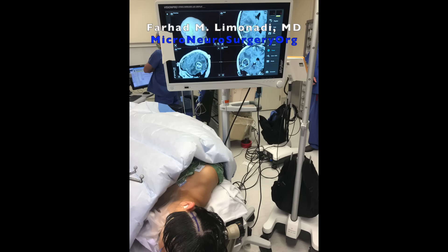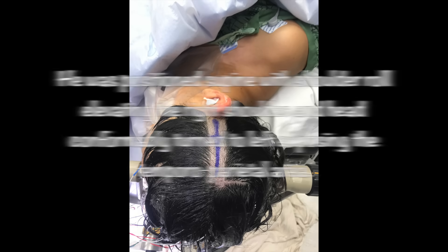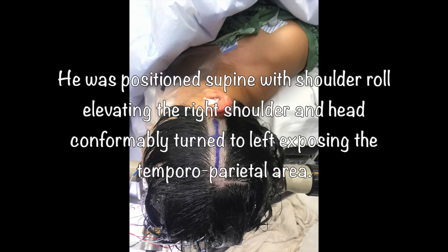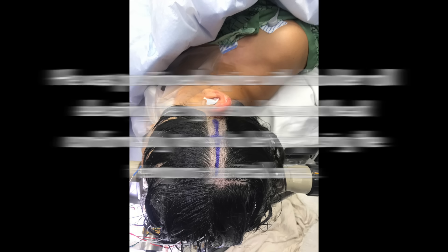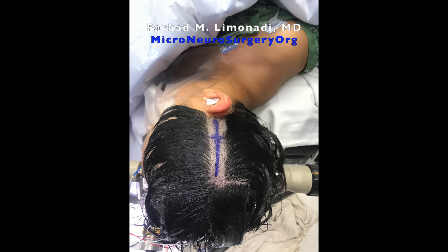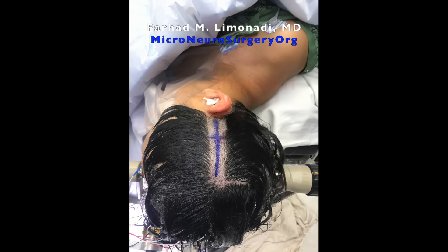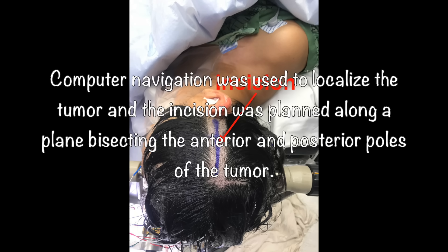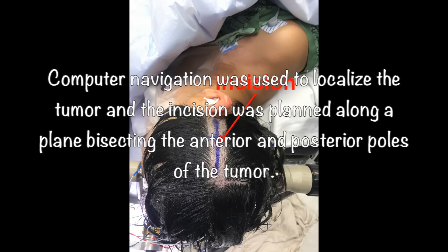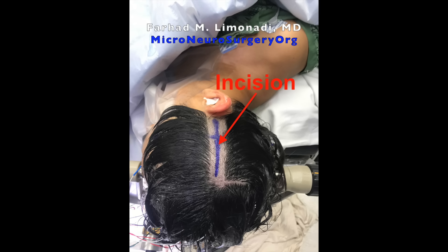Surgery was performed using computer navigation and neurophysiological monitoring with brain mapping. The patient was positioned supine with a shoulder roll elevating the right shoulder and head comfortably turned to the left, exposing the temporoparietal area. Computer navigation was used to localize the tumor, and the incision was planned along a plane bisecting the anterior and posterior poles of the tumor.